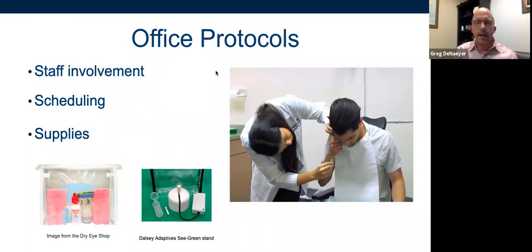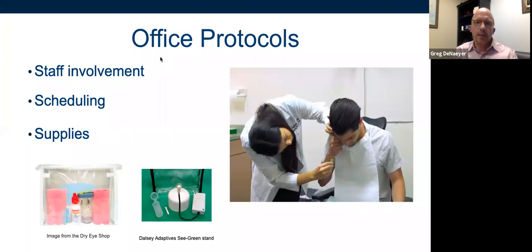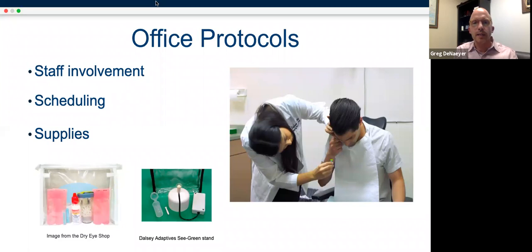So in my mind, especially for specialty lenses and scleral contact lenses, if you can have one key person at least, you might have a few, but one really key person that is knowledgeable, I think that goes a long way. And then, of course, I know probably most practitioners have highly qualified technicians that are part of the fitting process. They may even put lenses on. They may over refract. They may do the training.